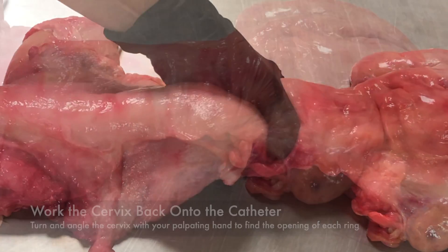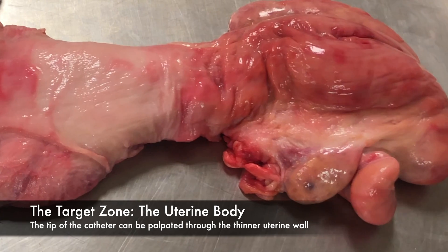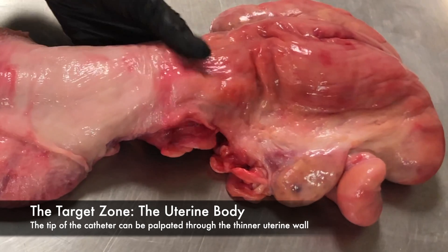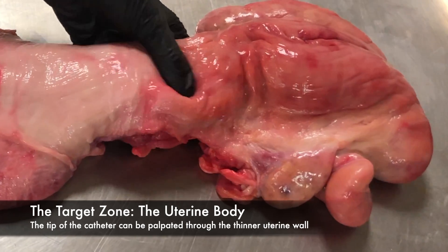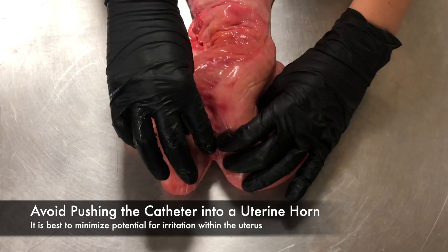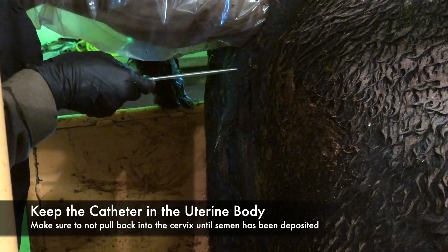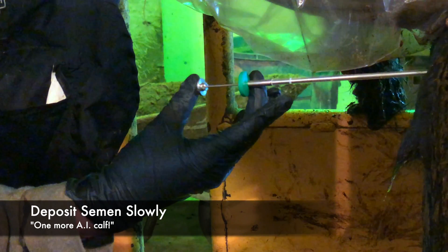To ensure you are in the correct spot, feel for the tip of your gun. If you are still in the cervix, you will not be able to feel the tip of your catheter very well. Since the uterus is much thinner, you will be able to feel the tip of your gun in the uterine body. You want to clearly feel a half inch to an inch of catheter in the body of the uterus. Avoid pushing the catheter farther into the uterus and down a uterine horn. We want to minimize any potential for irritation within the uterus. Keep the catheter in the same place, making sure not to pull back into the cervix until semen has been deposited. Deposit the semen relatively slowly, about as long as it takes to say one more AI cath.